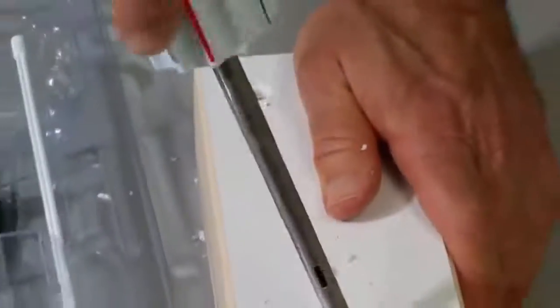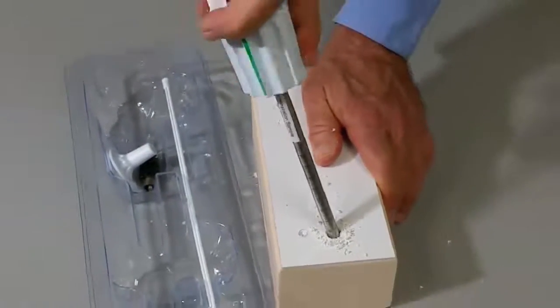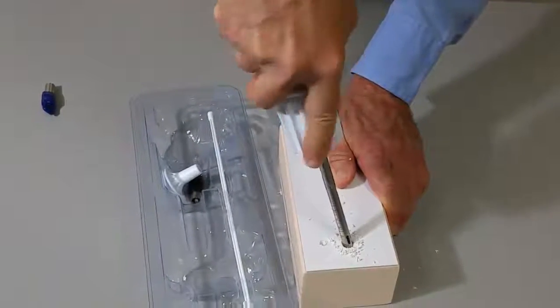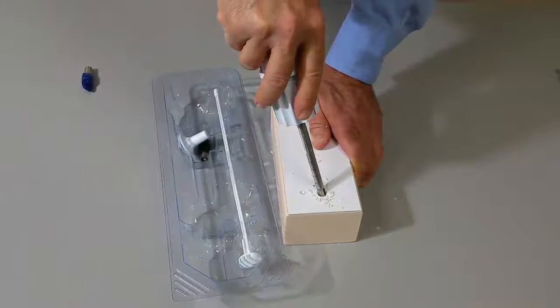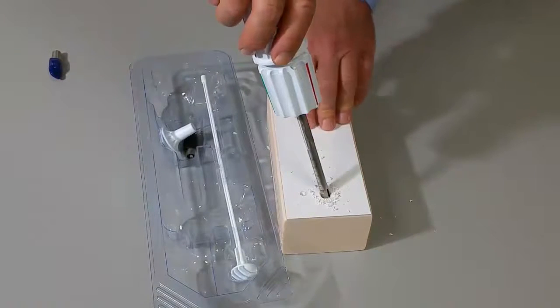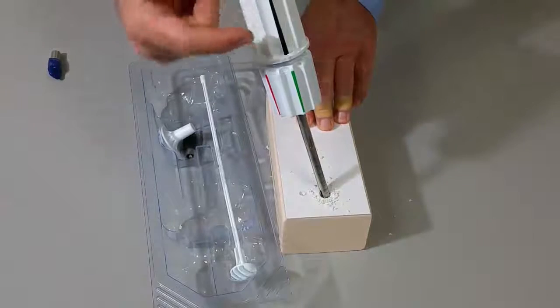We're going to again use that oscillating motion with light but adequate pressure to advance the device deep to the subcortical surface. If cortex is encountered during the advancing, you will feel a discrete increase in resistance, and that should prompt you to redirect the trephine or stop your harvest. At this point we're at the five centimeter depth.